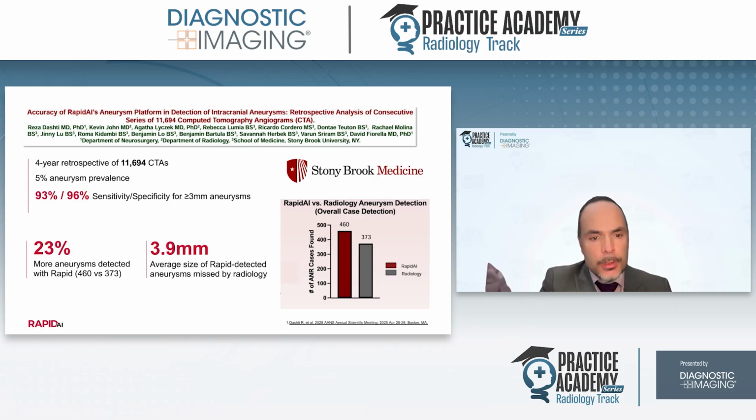The last point I want to make about their study is that the average size of the aneurysm that they found was only 4 millimeters, which is to say an aneurysm for which actionable treatment is absolutely standard in many cases. And so the impact is really quite high. As I said, they had accuracy down to 3 millimeters in their study.